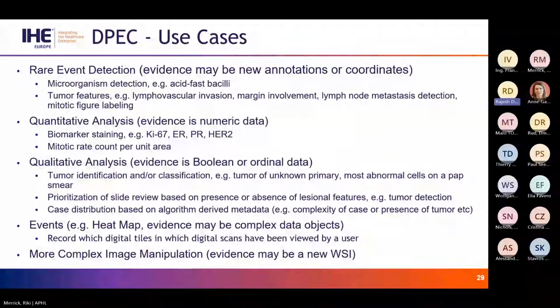That's just one example, but it might find many other aspects that are important for evaluation and send it back to the pathologist to review. The plan is to be able to send both quantitative and qualitative data. And you can see some of the examples there.